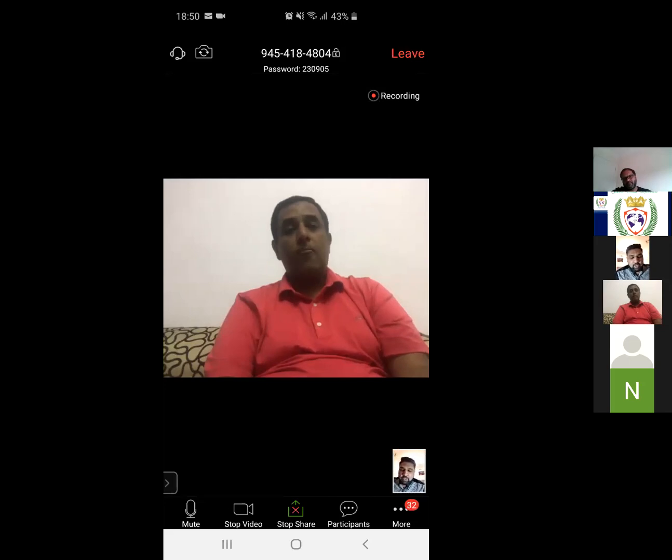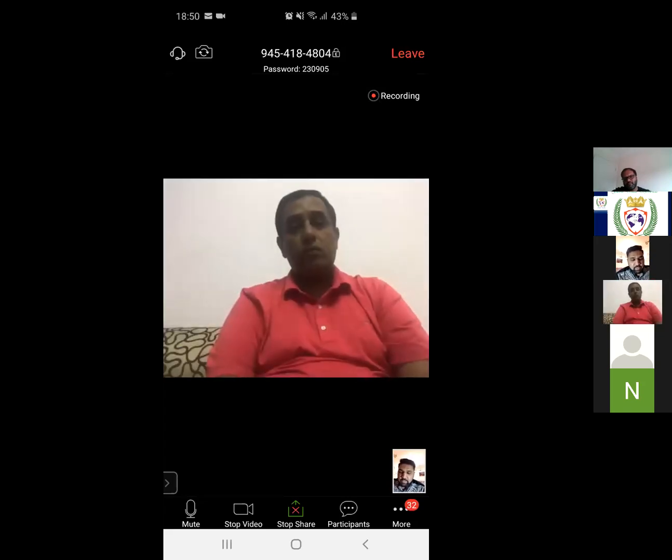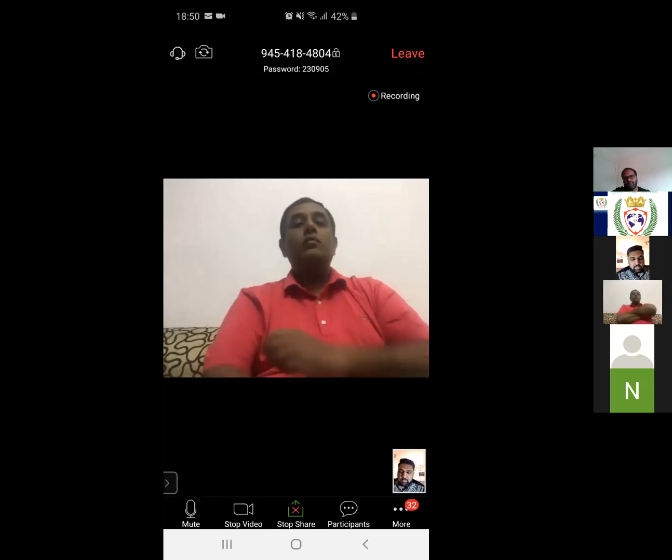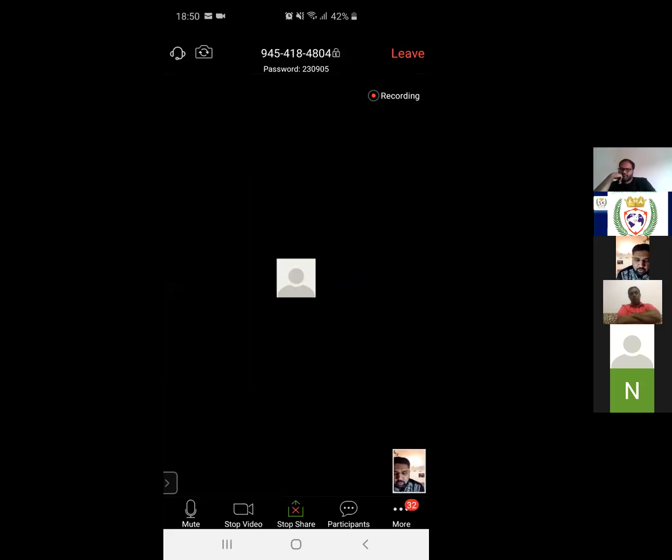And again, I was talking about doing zirconia crowns on titanium abutments. The interface is not that good. The metal to metal interface is better than the zirconia to metal interface. The prosthetic screw which goes through the zirconia crown also poses a bit of a prosthetic challenge because of the stresses generated there, leading to zirconia fracture. So this is my observation.